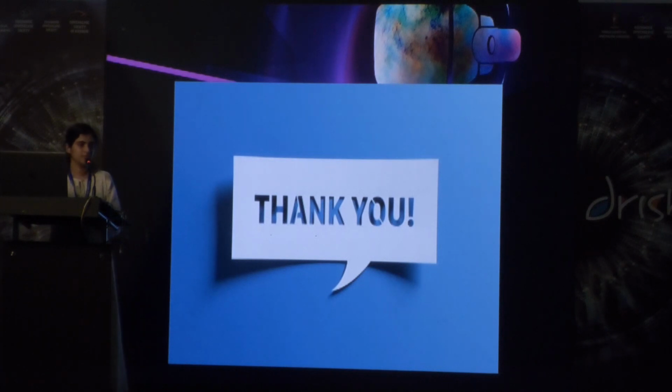Okay, very nice. But why is there a tendency for the temporal quadrant of the retina, as well as the vertical CD, you told, increased? Yes, sir. What about the arcuate zone? You have seen the fundus, the OCT. Any problem in the arcuate zone? No, sir. The temporal quadrant RNFL, you told, vertical cup disc ratio is increased. That means the arcuate fibers entering superior and inferior should have got damaged. That means the ganglions also should have been damaged. Yes, sir. You told generally temporal. Temporal means entire temporal. Temporal was significantly found in our study.